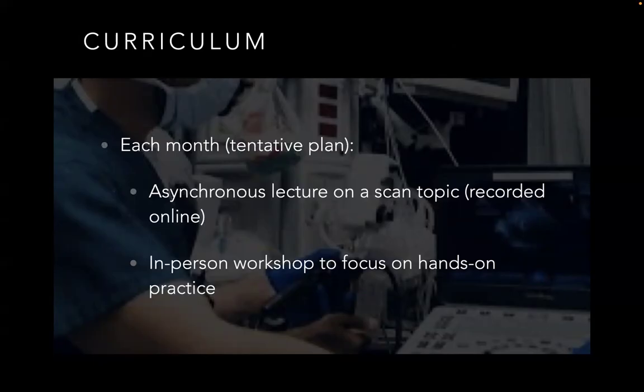In terms of the curriculum, each month there is going to be an asynchronous lecture on a scan topic, recorded online and provided to you via a YouTube link, so you can review the topic in advance of the actual workshop. And then each month, there is going to be an in-person workshop to focus on hands-on practice. We'll be practicing on ourselves and scanning ourselves to get some practice on how to acquire the images.